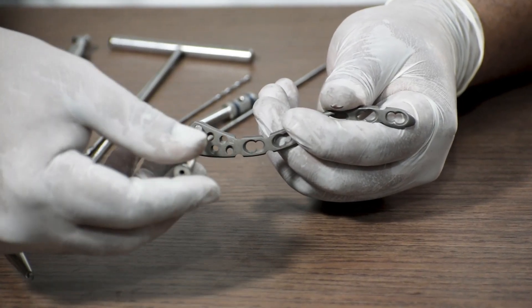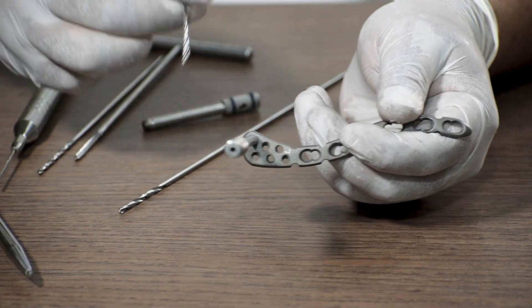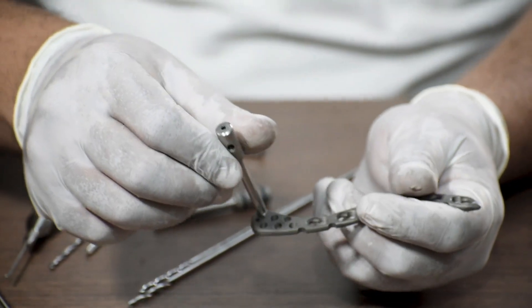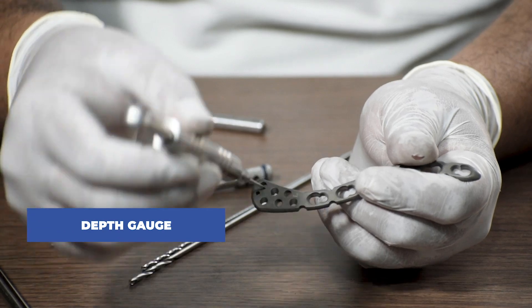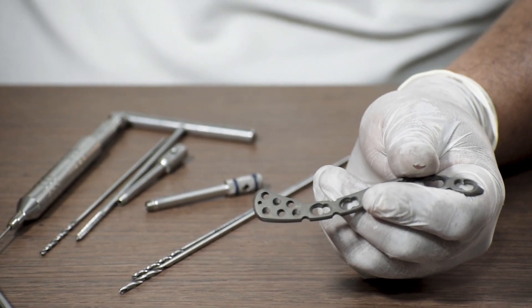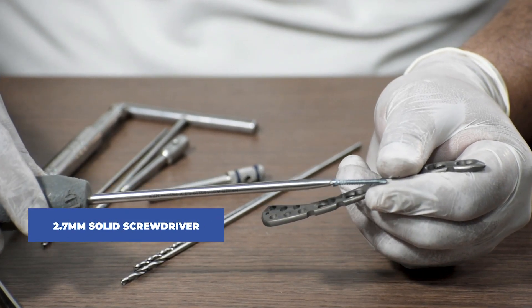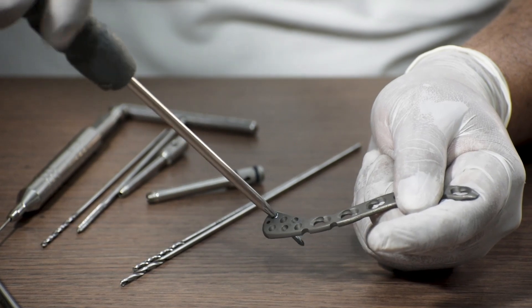We attach a 2.7 mm drill sleeve in the locking hole. Once the locking drill sleeve is connected, we take a 2 mm drill bit and drill through the sleeve. Thereafter we remove the locking sleeve and use a depth gauge to measure the length of the screw needed. After measuring, we fix a 2.7 mm locking screw using a 2.7 mm solid screwdriver — connect the screw and fix it in the drilled hole.